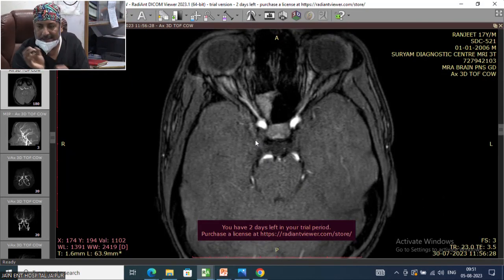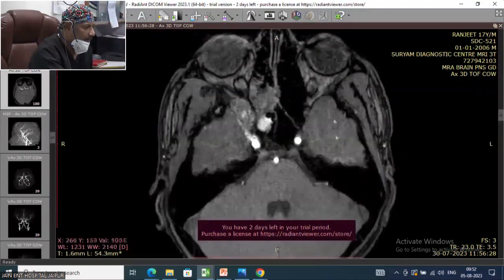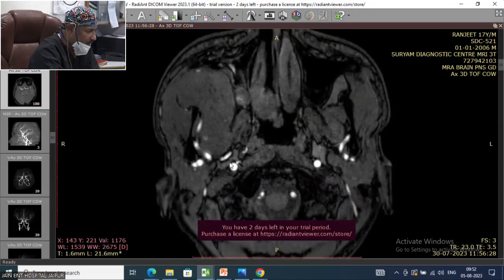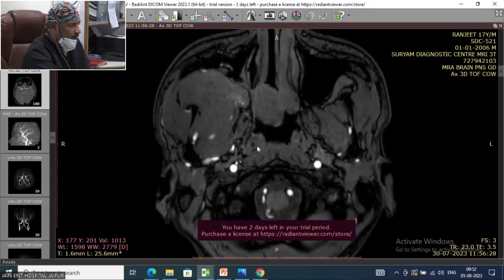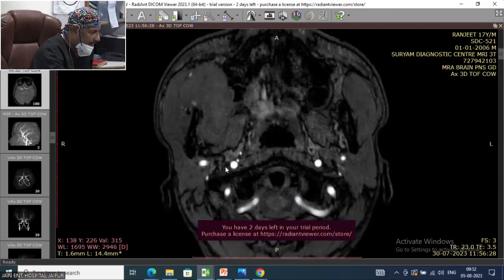The cross flow at the level of the brain can be seen well on the angiographic study. This is very important when you deal with tumors around the carotid artery. Third important information from the angiogram: we know the principal vessel supplying this tumor is the internal maxillary. How to follow this and how the vessel is entering?